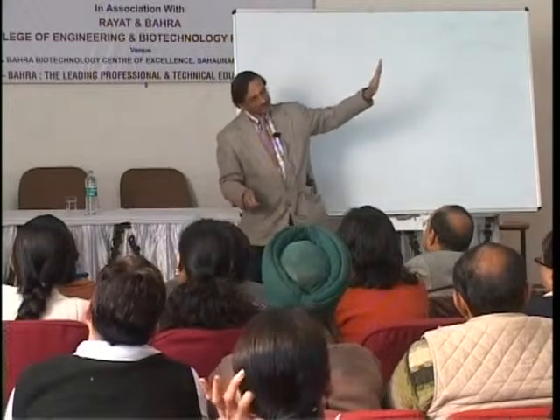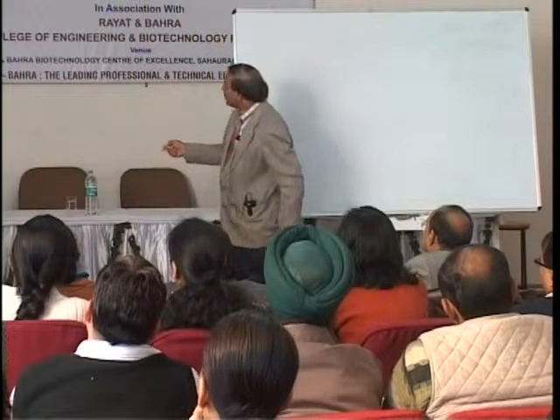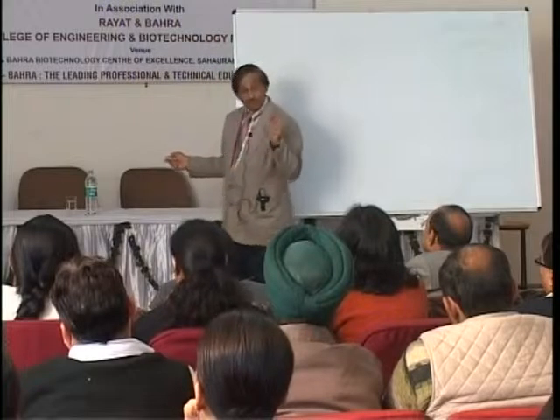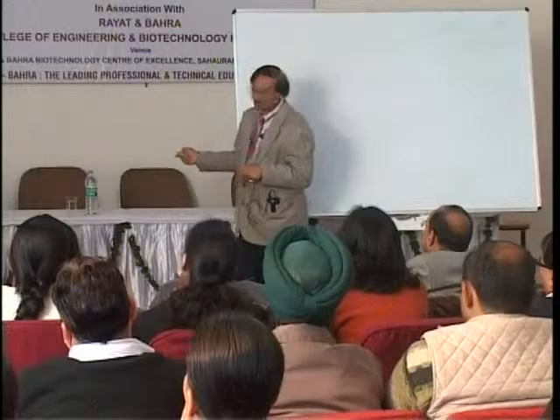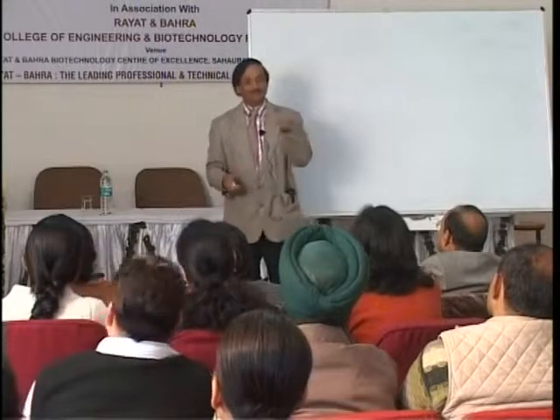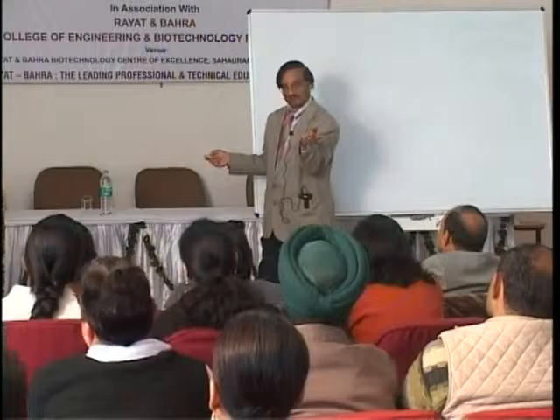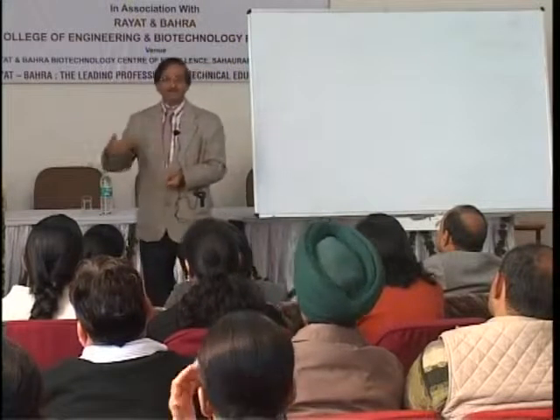The learning should come from a biomedical model-based registration system, which will automatically identify the features for matching, which will improve the validation and accuracy of registration. And of course, in case of a failure, it should give us an algorithm to find out where the failure is and to rectify it. You need micro to macro scale fusion.